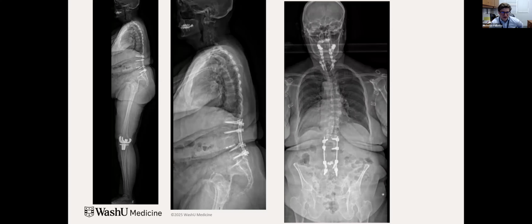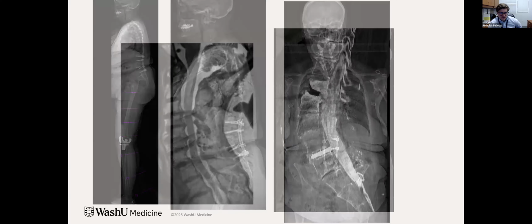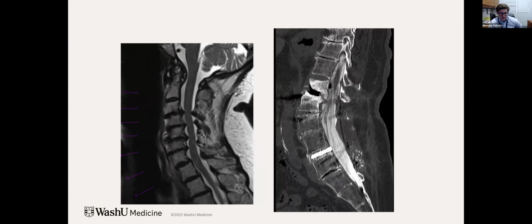And so you can see on the long lateral, she has the previous instrumentation. She's bending her knees to try to stand up straight. What's difficult to see here is you have a complete failure above her fusion, which is in part the cause of her inability to stand up. And so actually, cross-sectional imaging demonstrated she had this stenosis, which is probably underrepresented here, but it's quite severe from C3-4 and then also at the cervical thoracic junction at C6-7 and C7-T1.